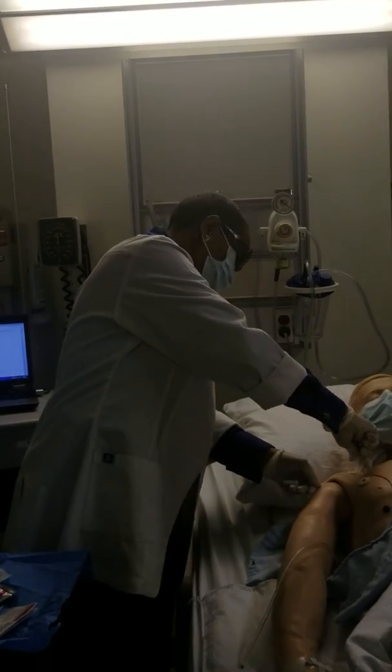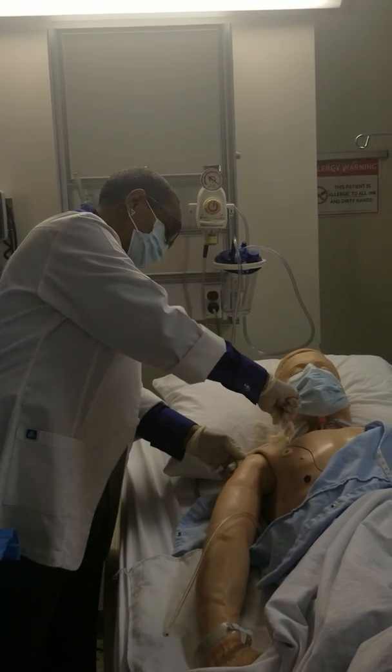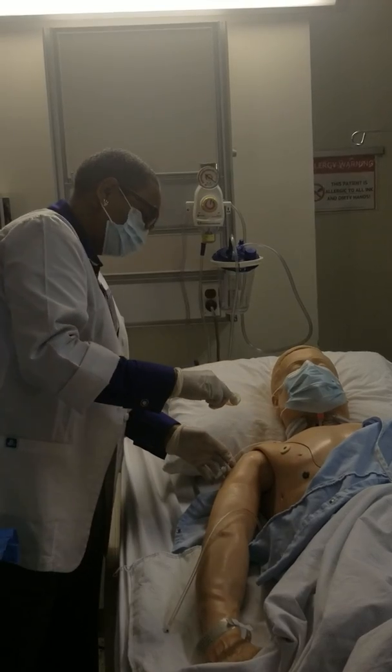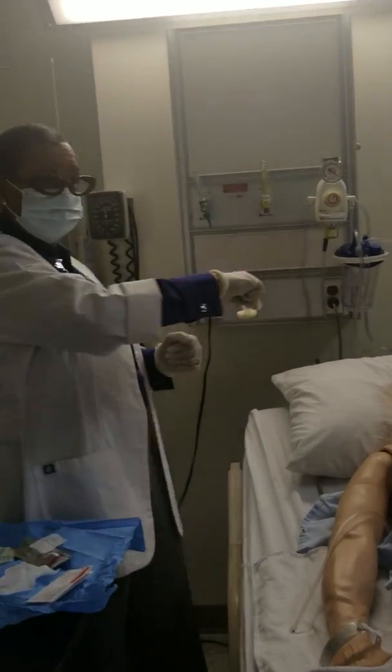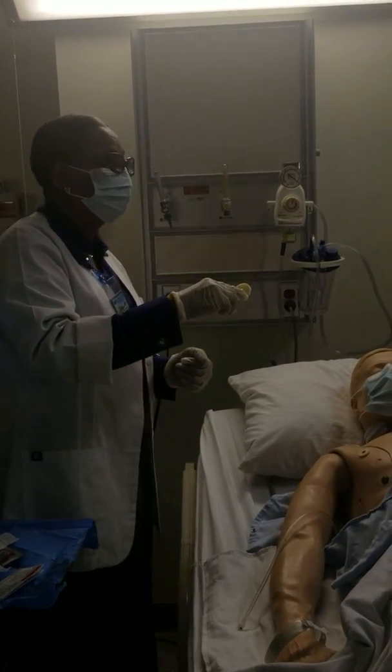You just scrub it, and I can't do it here, but you'll see them. They'll just scrub that site. It's sutured in, most times. That's why I'm holding on to it so it won't go. But you actually do vigorous motion back and forth. Back and forth. That's the difference when you're dealing with this. There you go.